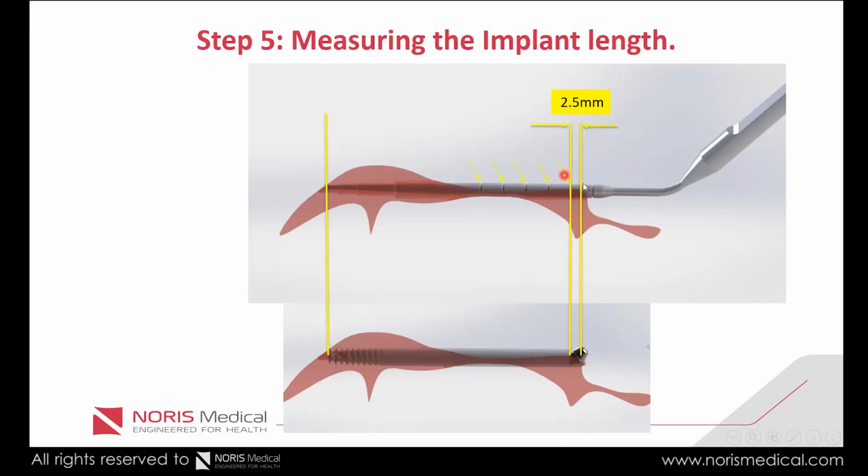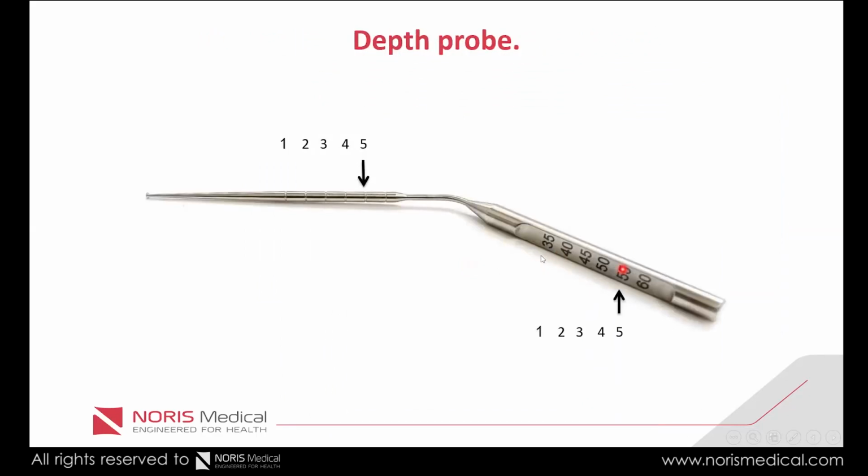Okay, in this case, it's 5. And 5 millimeters tell us that the length is 55 millimeters, and we see it here. 1, 2, 3, 4, 5. Or if we count from this way, 1, 2. We always come to the same distance.